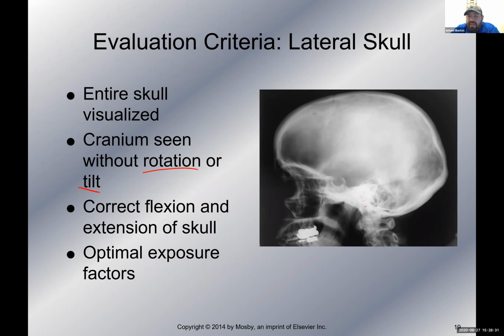And the last one would be the EAM, which is hard to see, but it'd be a hole over here, right? So we saw one hole, no rotation, no tilt. What if I saw this? So one hole in front, one hole in back. What does that tell me? If you said rotation, you are correct.